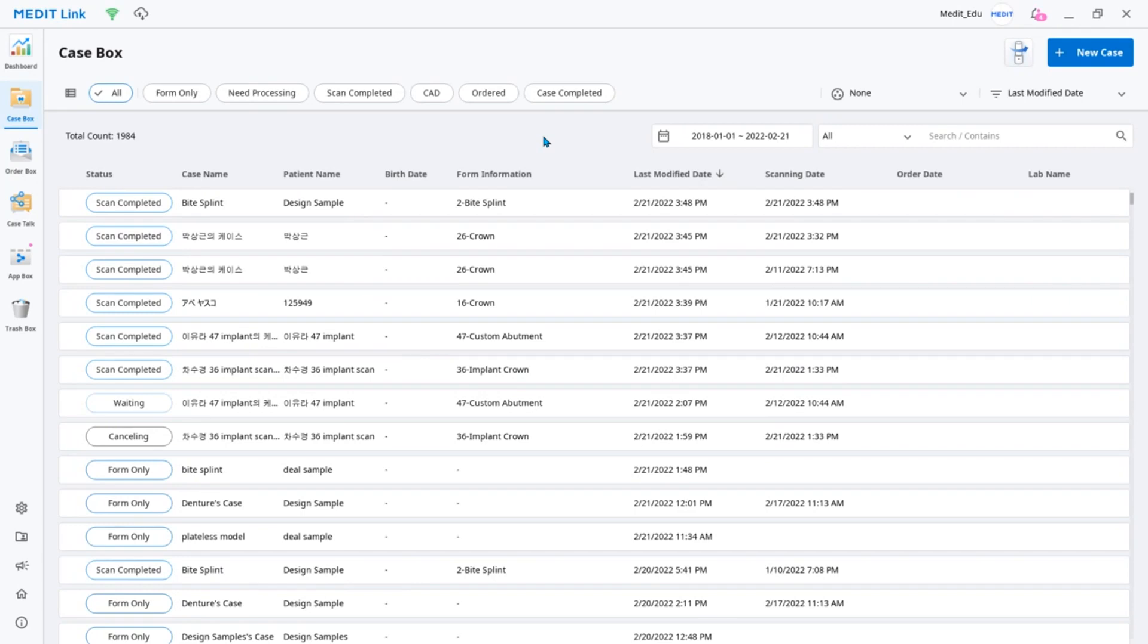In this video, we will introduce the Medit Design app. Medit Design is a new name for an upgraded and improved version of our Medit Compare app.